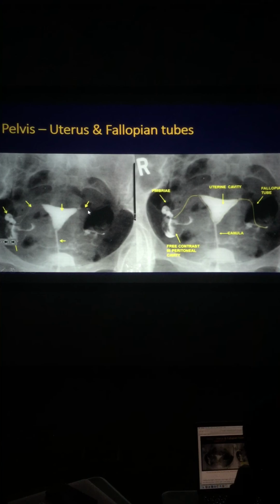So in a nutshell, I think I've shown you a brief idea of the abdomen, how you could have an idea by looking at the plain X-ray. In the next lecture, I'll be giving a more specific description of CT scan and disease-related conditions, how hepatitis looks, how a hepatic cyst would look, how pancreatitis looks, and how a pancreatic tumor would look, all kinds of things. So till that time, if you have any question, you can ask me.